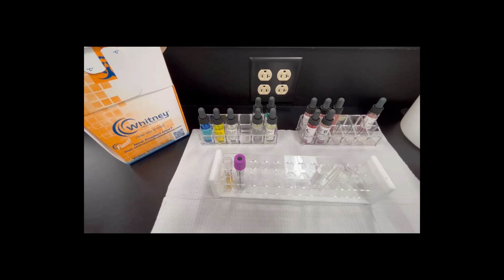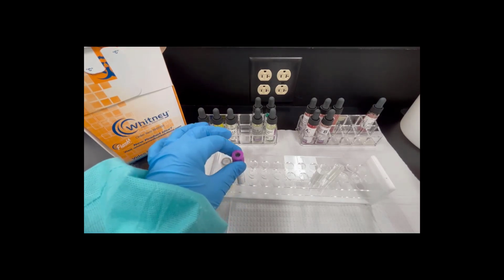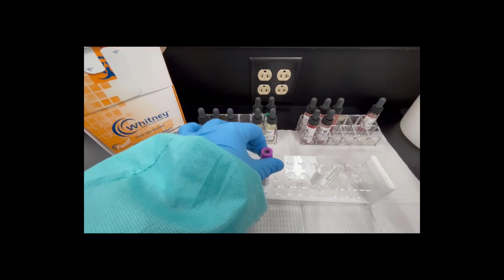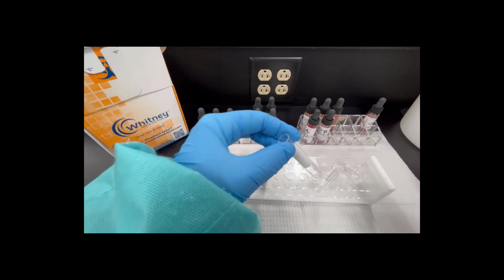The next thing we're going to do in the lab today is make a 3% washed cell suspension. For that, we are going to grab the patient sample. We need the cells for this. I'm going to grab a 12 by 75 tube.